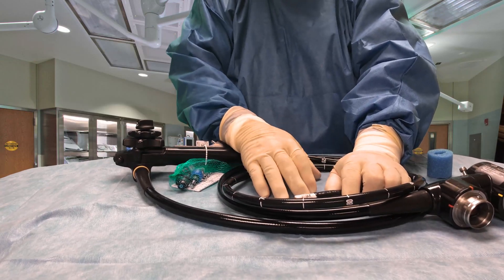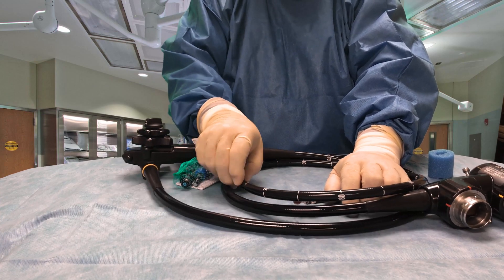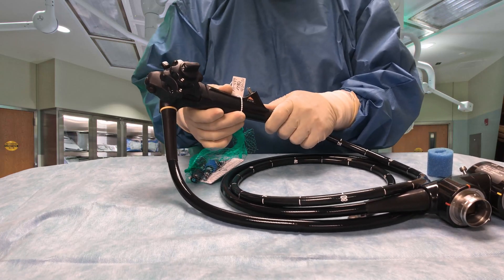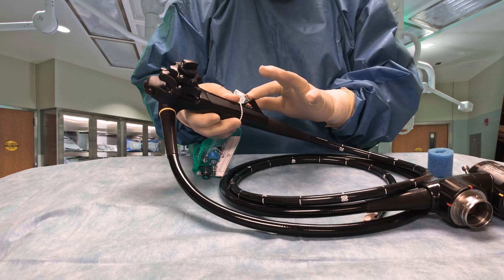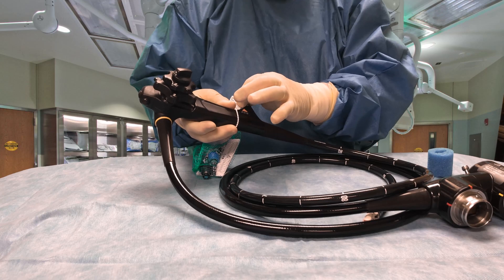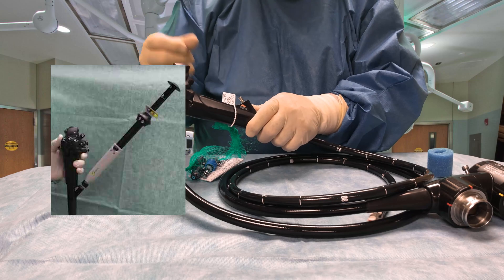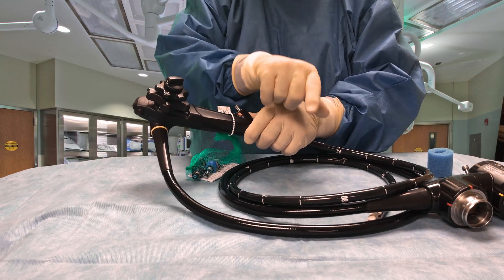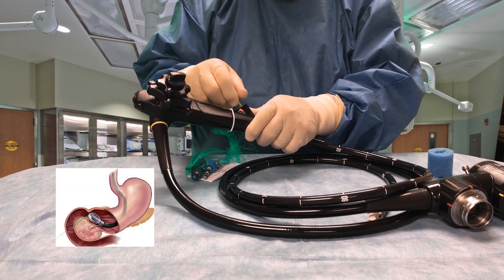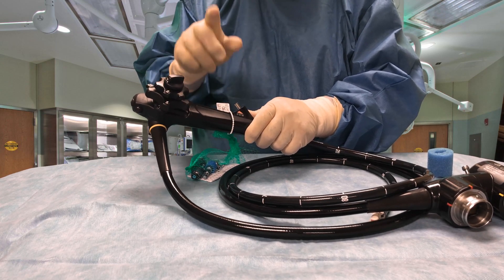There are other instruments that can go through this as well. It has a fairly large working channel. The working channel is a little different from most endoscopes in that it has a luer lock on it. The luer lock is so that we can lock in certain types of needles and instruments onto the scope that go through the working channel out the distal tip, in order to obtain biopsies and aspirate.